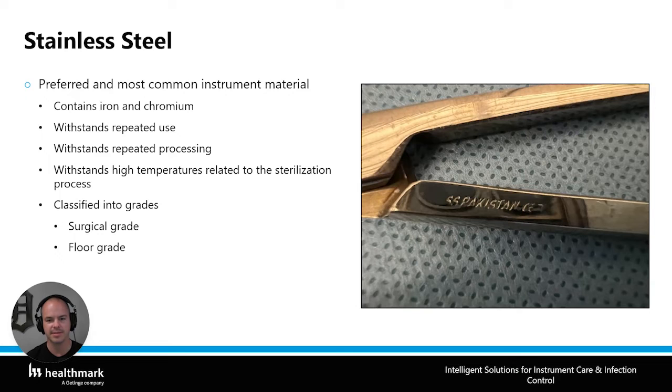Now, they are stainless steel and they can be sterilized, but they're just not supposed to be reprocessed in most cases, unless it comes with an IFU for reprocessing. Then it is really meant to be single use and discarded.